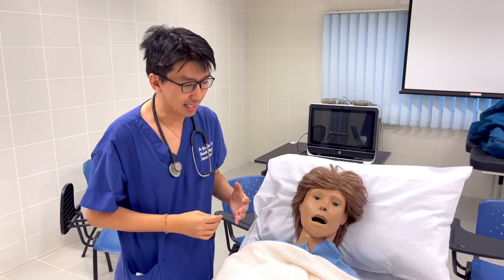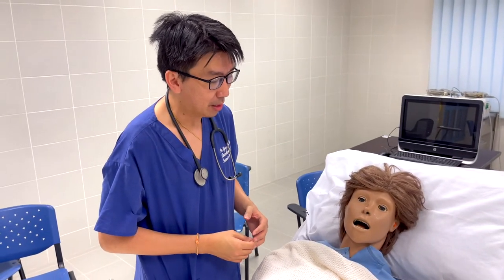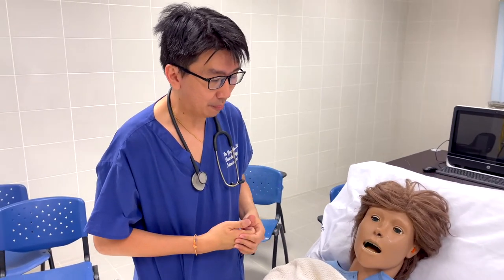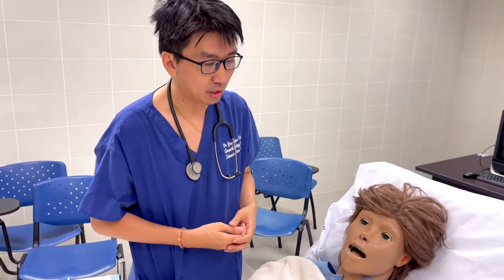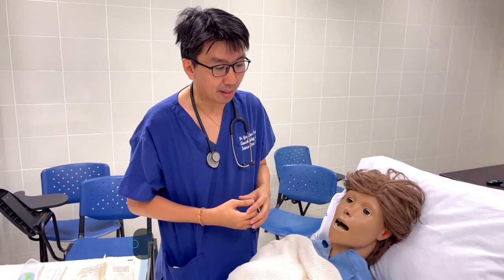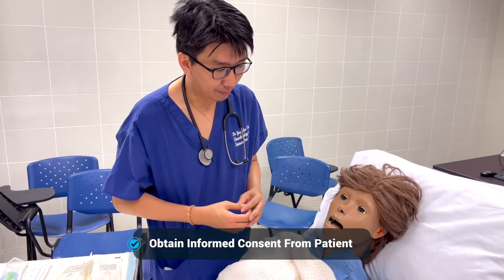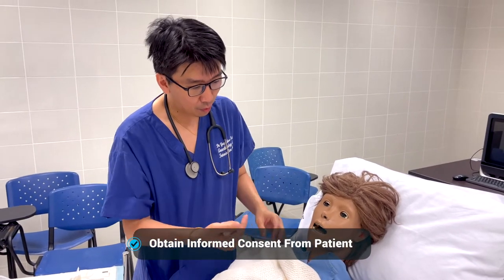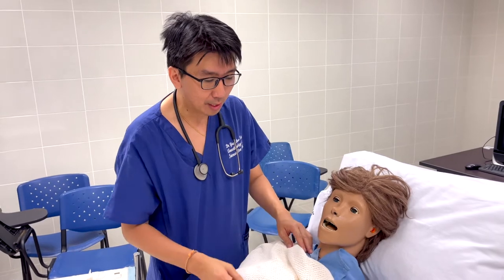Hi Mrs. Alice, I'm Dr. Yap. Today I'm going to insert a Ryles tube for you because you have a bloated abdomen and cannot swallow properly, so we are concerned you may have aspiration. We want to insert this tube to decompress and remove the air from your stomach. I'll explain the procedure — we place a tube through your nostrils and it goes into the stomach.